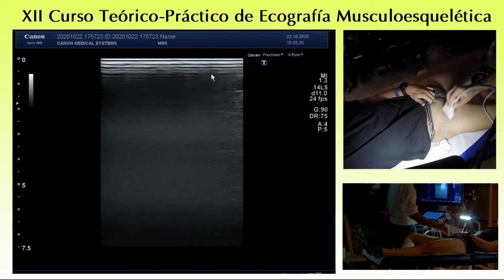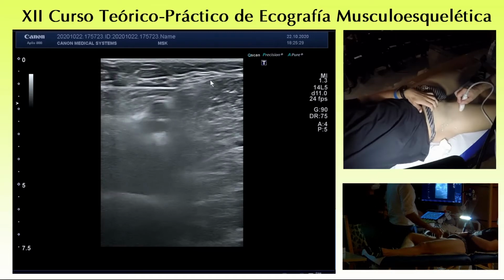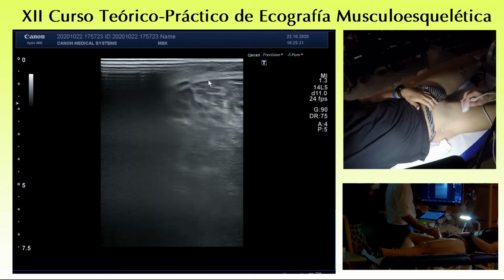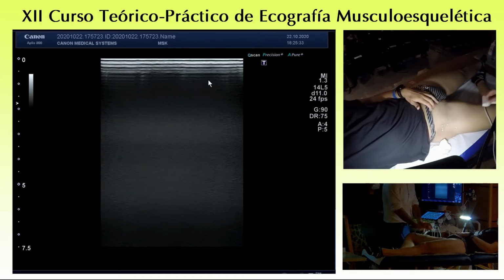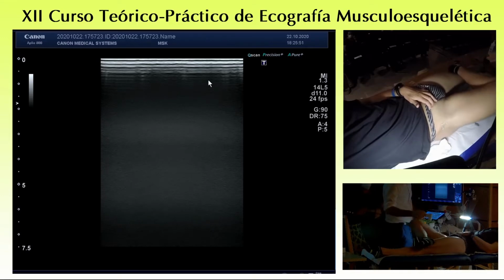Okay, but this is nothing specific. The only thing to study the adductor muscle is the correct position of the leg: in external rotation and abduction. Instead, if we want to check the distal insertion of the psoas muscle, the best position is to put the heel over the knee, like this.